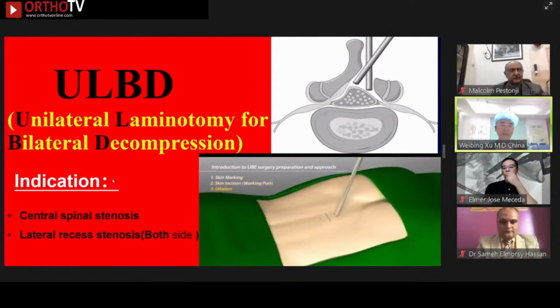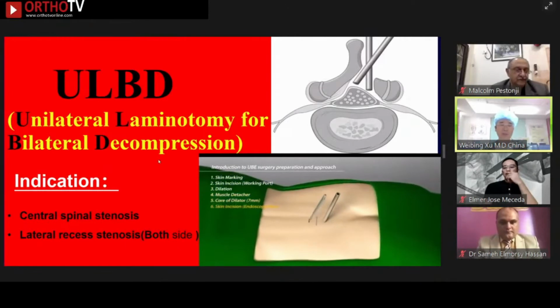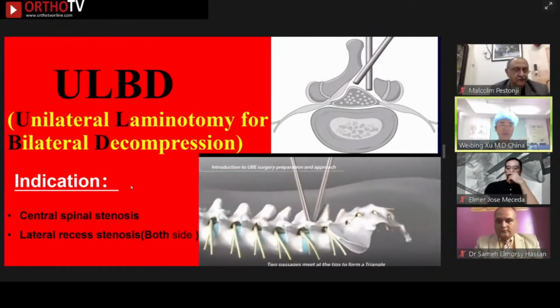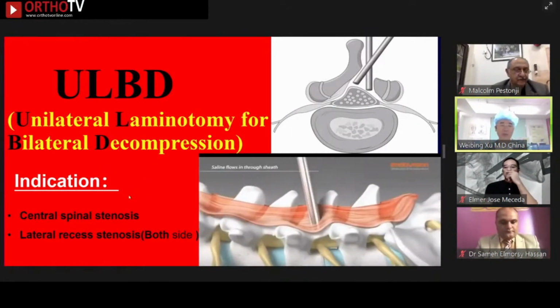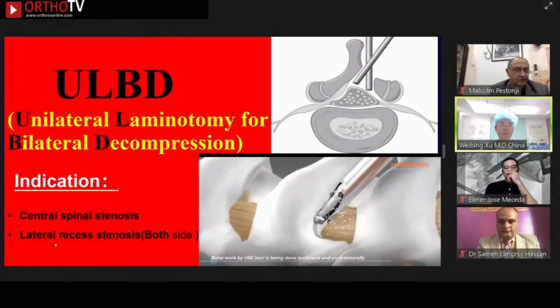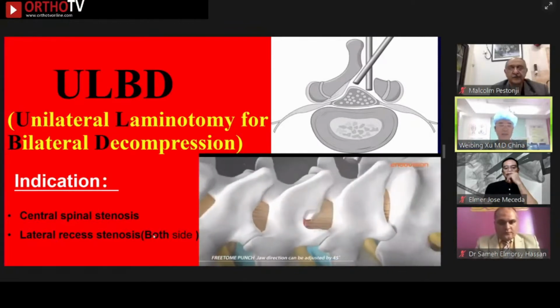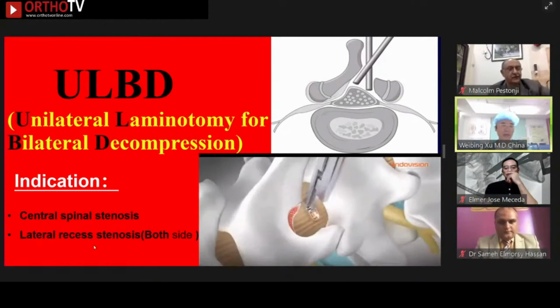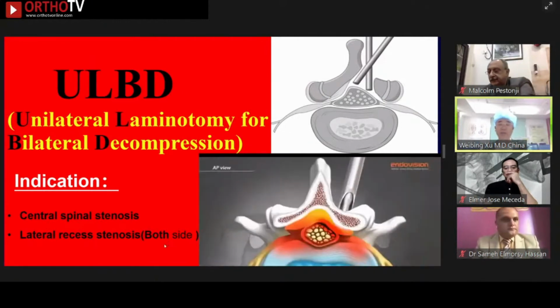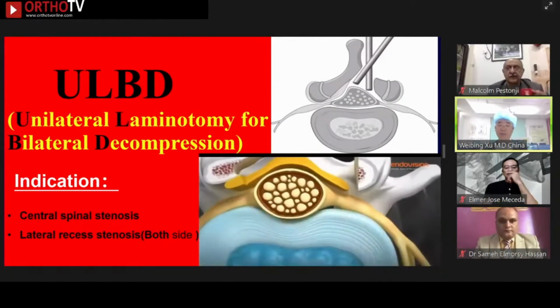ULBD means unilateral laminotomy for bilateral decompression. The indications for ULBD include central spinal stenosis and both-side lateral recess stenosis. Sometimes it includes foraminal stenosis. This video is the ULBD.